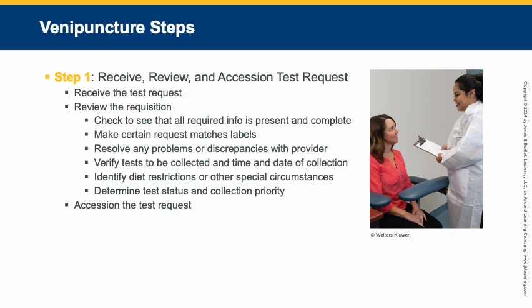Resolve any problems or discrepancies with the provider. The provider would be the doctor or the nurse practitioner, whoever ordered the test. Verify the test to be collected and the time and date of collection, because some tests need to be in the morning, some need to be at night, some need to be postprandial, which means 2 hours after the patient has eaten a meal. So, you need to verify all of that.